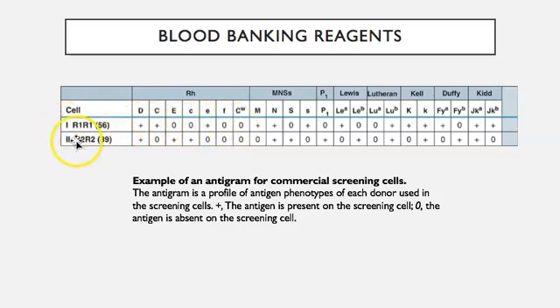This is a second donor that helps make up the second reagent vial in this screening set. And you can see their profile. So what they're doing is looking for one that's maybe positive, so we can get positive and negative reactions for each of these antibodies. And then the third, if it was a 3 vial screening set, you would have one that was D negative.